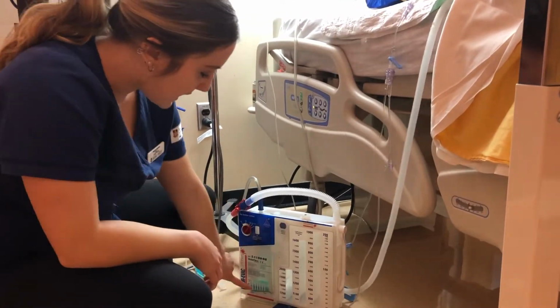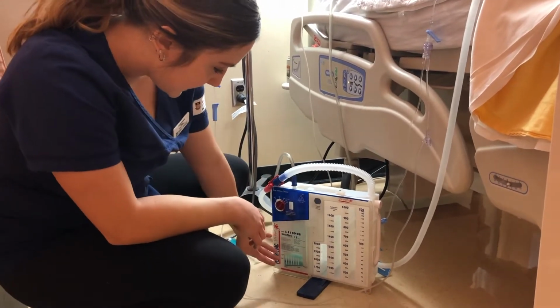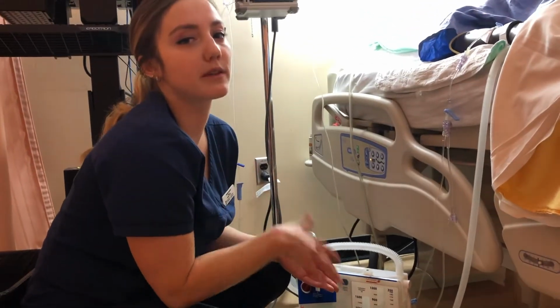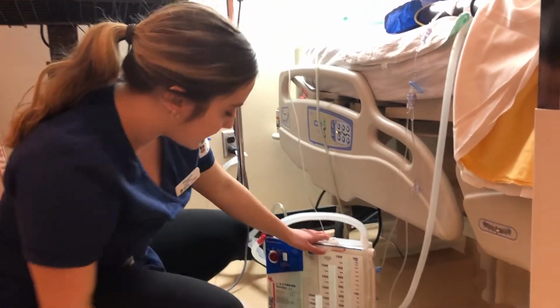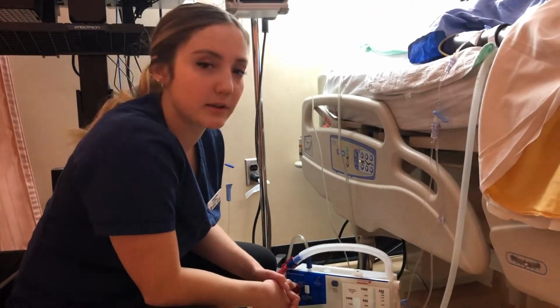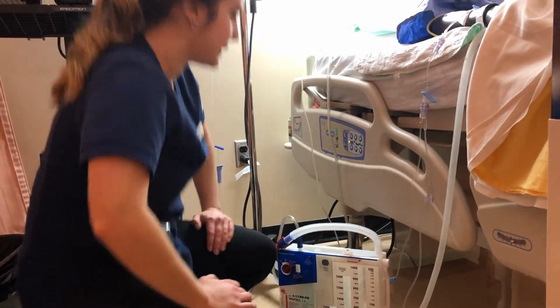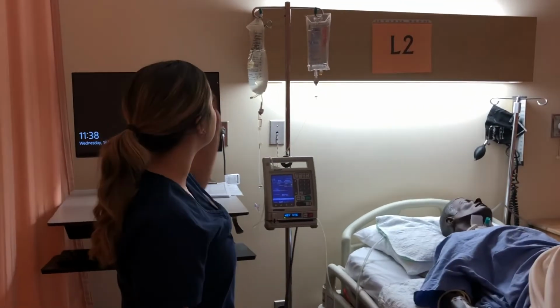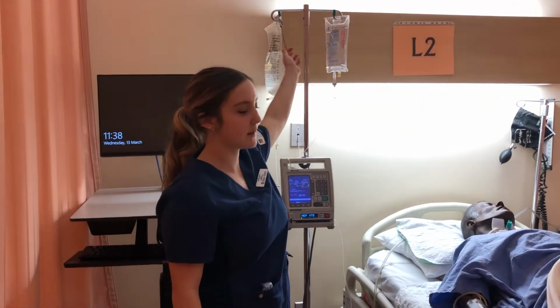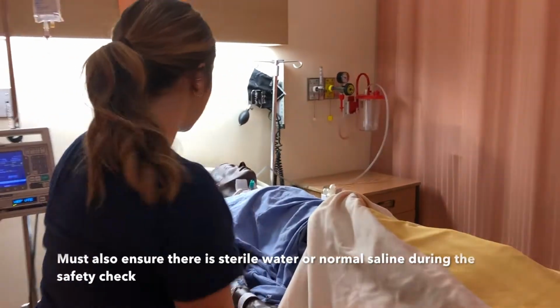I'm also noting my air leak chamber here, noting if there's tidaling, which is normal because tidaling is when the volume moves with breathing. And if there's any excessive bubbling, that means that there's an air leak somewhere, but I don't see any bubbling, so that's good. The other part of our safety check is making sure that there are 2 clamps at the bedside or with the patient at all times in case there was an air leak. So I'm just going to position my patient now.